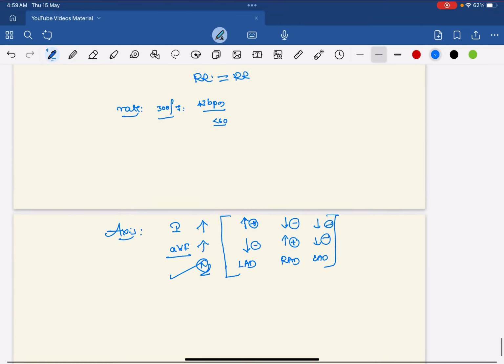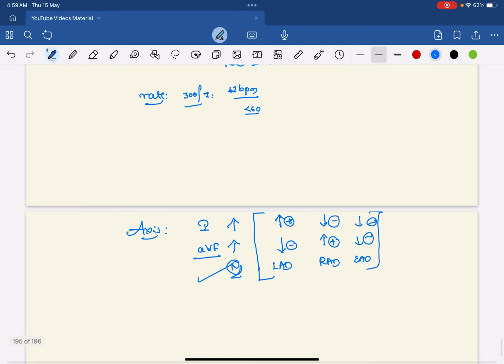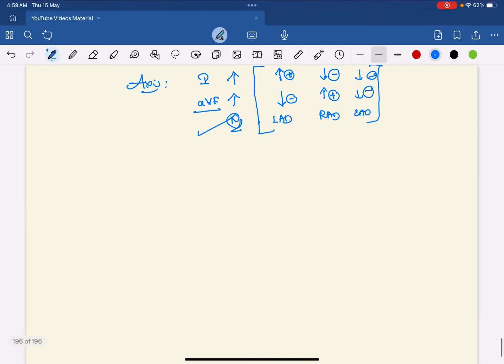So the abnormalities so far are no P wave and bradycardia. In ECG interpretation there is a rule of 4. What is the rule of 4? The first 4 things are history, rhythm, rate and axis. The next 4 things are waves: P wave, QRS complex, T wave and U wave. The next 4 things are 2 intervals and 2 segments: PR interval, QT interval, PR segment and ST segment.